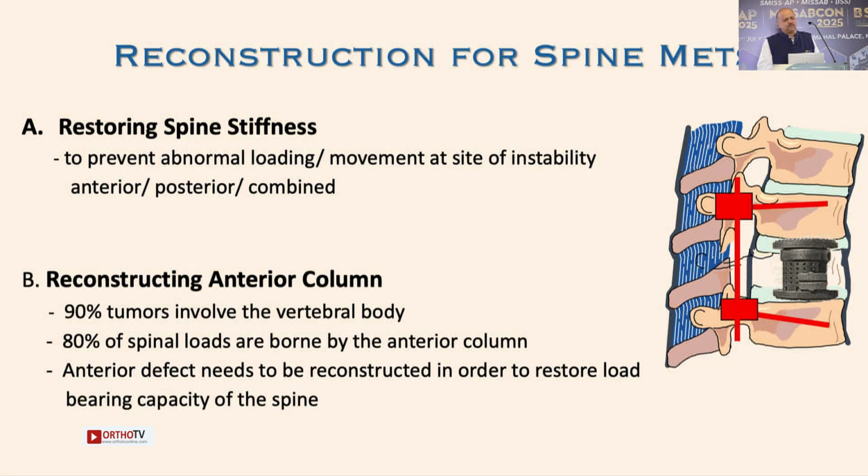Whenever we are thinking of reconstruction for spinal metastasis, you must remember two things. One is you want to restore the stability of the spine back to what it was before the metastasis developed. And for this you require to stabilize the spine today with pedicle screws. The posterior surgery is preferred because the anterior part is usually involved in the disease process. The vertebral bodies are osteoporotic and therefore they may not have good hold, and you can't do multi-level fixation anteriorly.